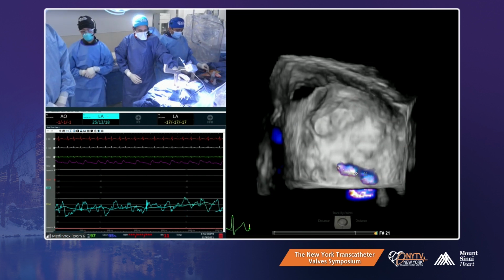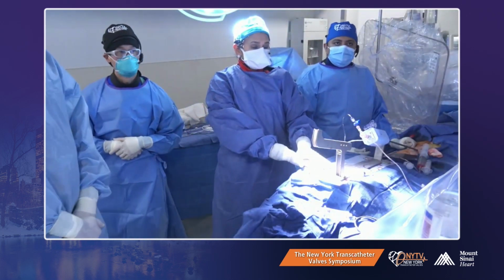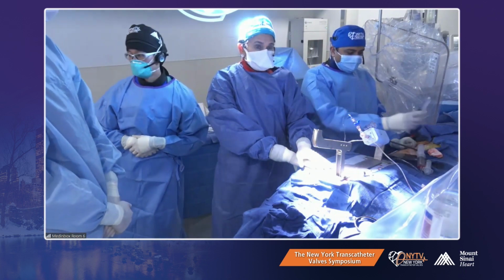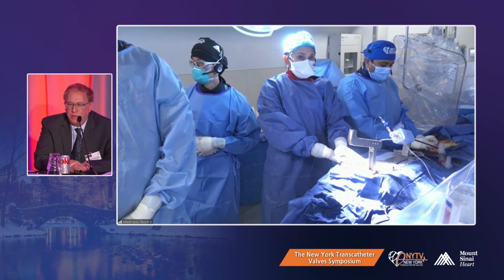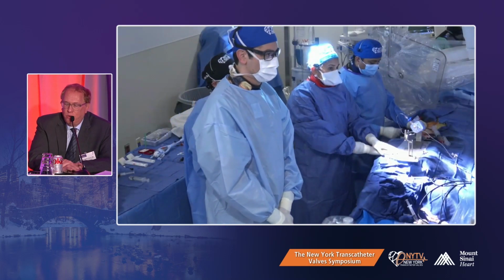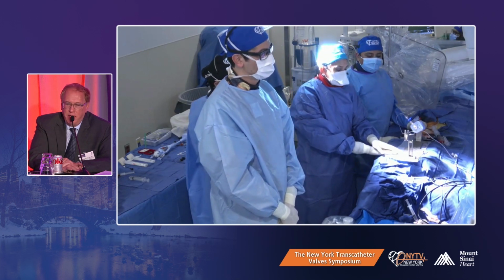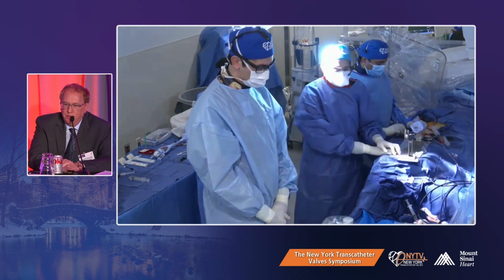That was really nice, and it's also good for teaching the audience how important the transseptal puncture was. I think it also shows the great value of live cases and the help that a panel in constant communication with live sites can be. This was great, back and forth, and I think the patient benefited. Great case, everybody. Beautiful demonstration, wonderful result. Thank you.